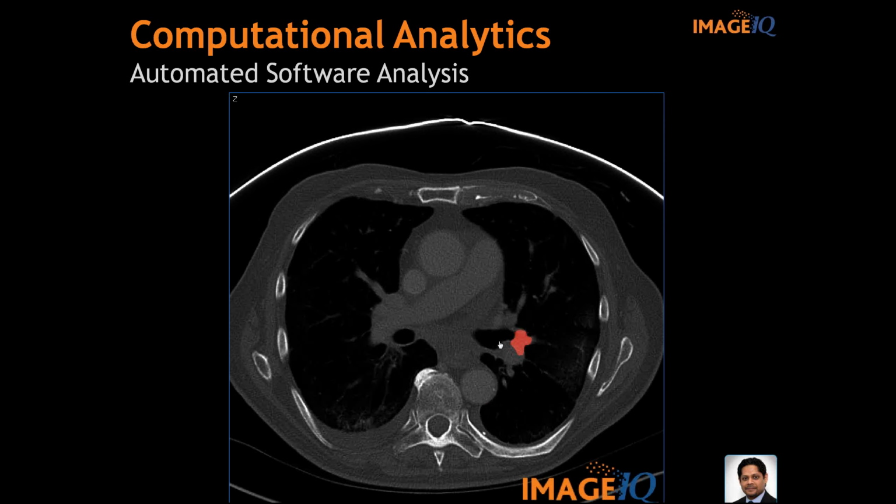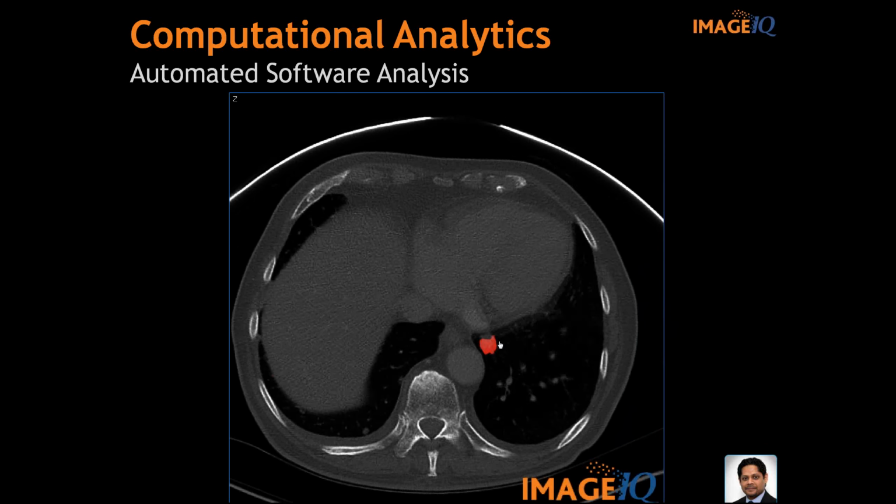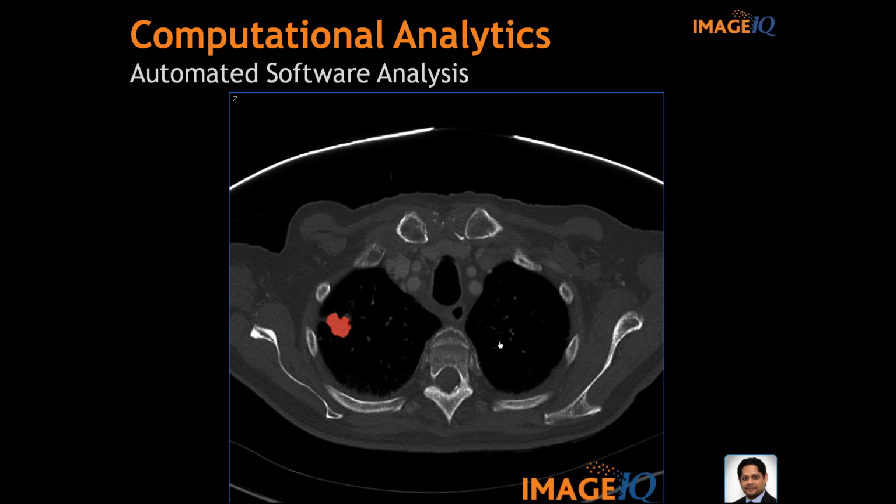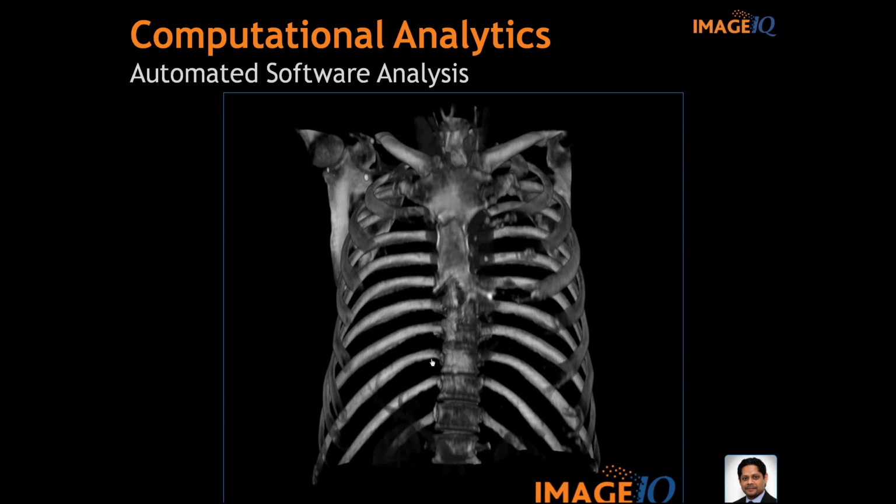So it's overlaid, and what we required for this sort of analysis is that the two scans from the two different time points were co-registered so that they're in the same coordinate system, and then you can track each of the lesions with respect to one another over the time points. I'm all about color, Amit. I like the color there. Two different time points displayed in two different colors on a single image is pretty helpful. Right, it really paints the picture nicely.